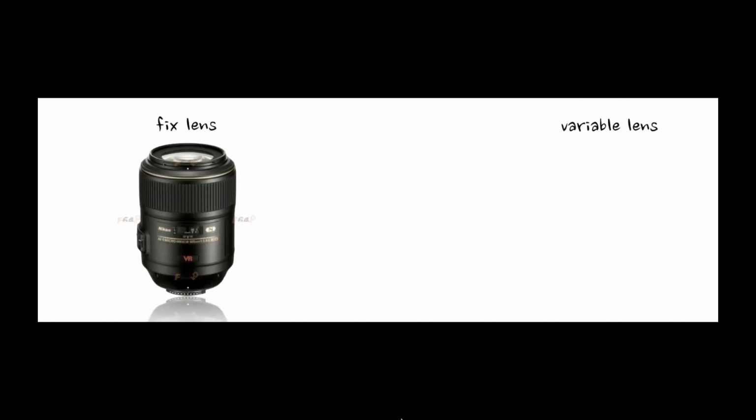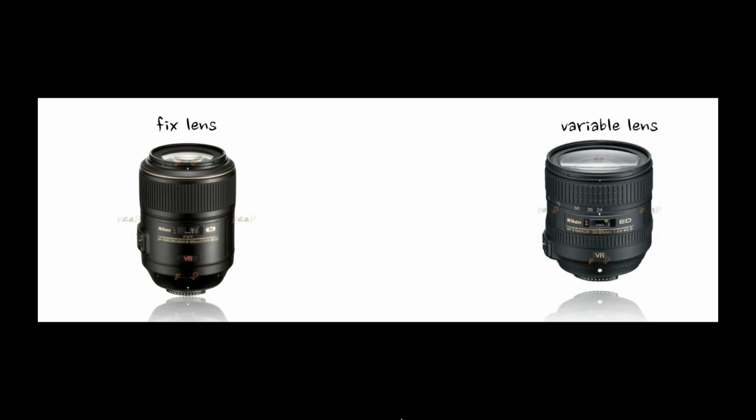For me, I always try to simplify everything. And to simplify it, I want you to understand the difference in the two types of lenses that are out there. You have fixed lenses, and what that really means is the size and the weight of the lens is permanent. You can't really change that. You can rotate the lens and zoom in or out, but the lens doesn't change in size. It actually stays the same all the time. And then you have adjustable lenses. And these are kind of more zoomy lenses where as you move, the lens gets longer or shorter.